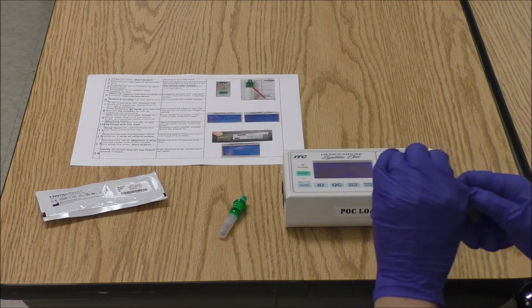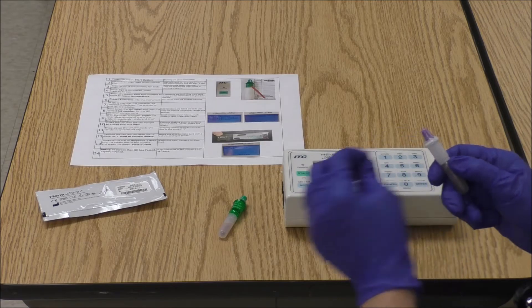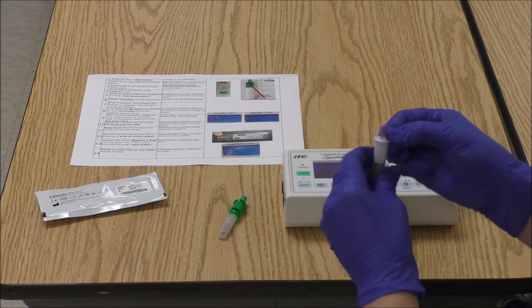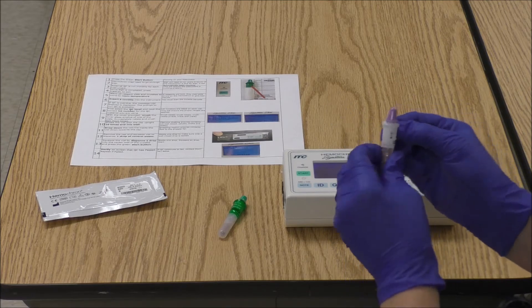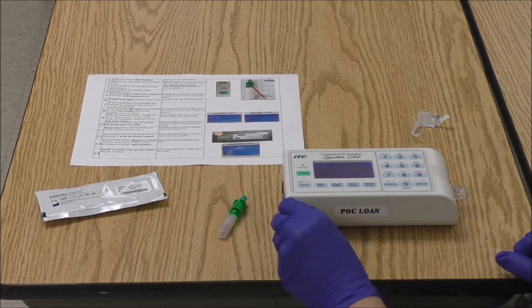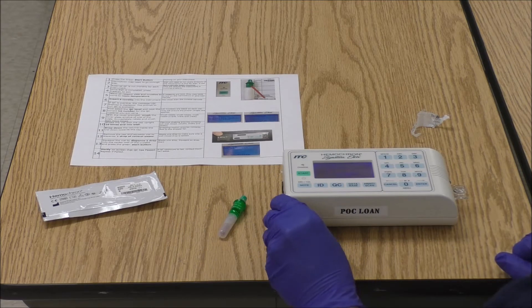While the cuvette is warming up, you have 5 minutes until you can't run the QC anymore. Go ahead and unwrap your QC vial. Tap to get everything to the bottom. Then crack 3 times, rotate, crack 3 times, rotate, crack 3 times, and shake it.